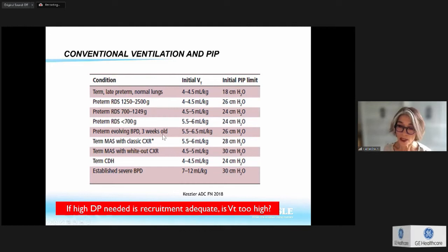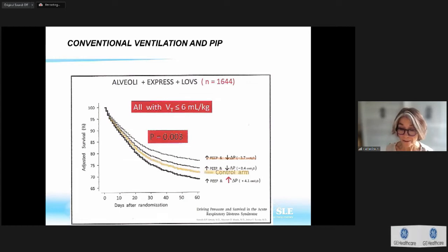When I ventilate the patient with low compliance, we will use low tidal volume in a low compliant lung. But because we have a low compliance as well, it means that if I don't have any problem of resistance, the recoil will be very fast, and I will be able to manage my CO2 washout by increasing the frequency in those patients.